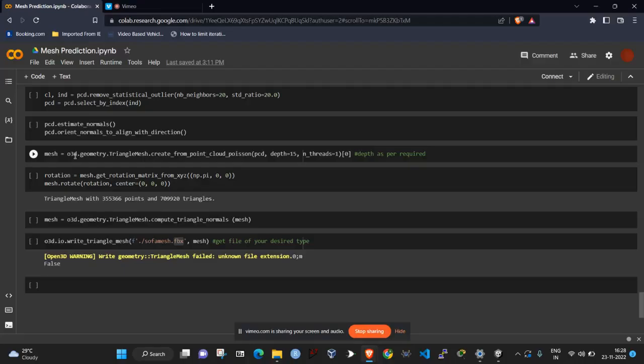The faces usually consist of triangles, that is a triangle mesh, quadrilaterals, or other simple convex polygons, n-gons. Since this simplifies rendering, but may also be more general, composed of concave polygons or even polygons with holes, we calculate the normals and set the center of the mesh first and then get out a mesh object, which will be saved as an OBJ file.